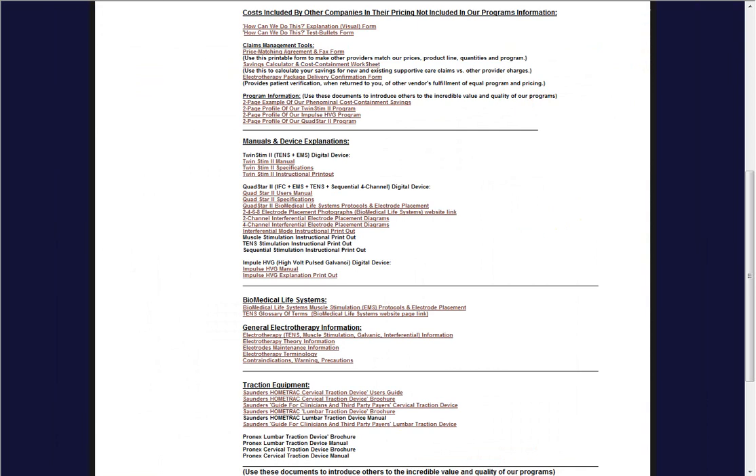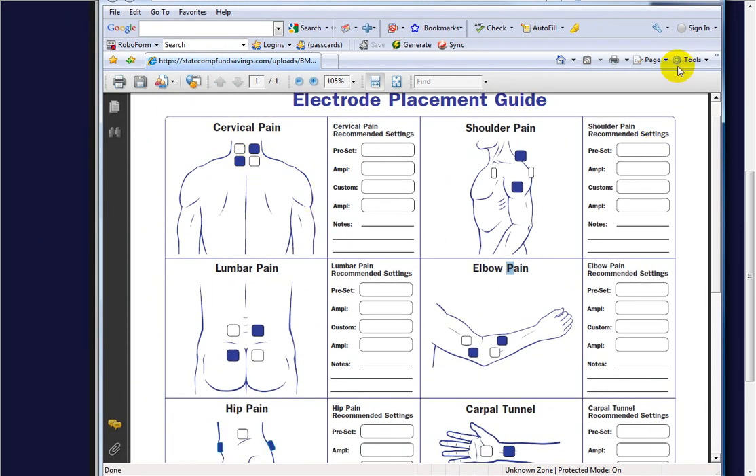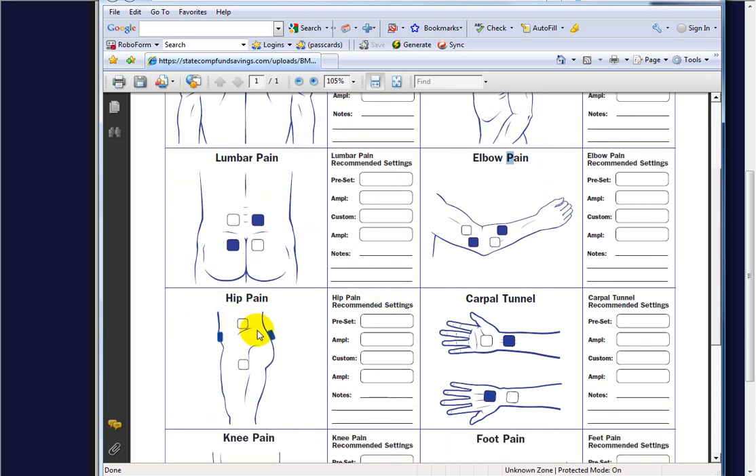Biomedical Life Systems is the manufacturer of our QuadStar 2. For cervical pain, one lead wire would go bottom left to top right, and the other top left to bottom right, so the current criss-crosses. The diagrams show different pad placements — you don't want to put electrodes right on bone; you want to give it some space. When the currents interfere at the center it spectrums out, and you can either pinpoint a small area or work a large area, though you may need to turn the amplitude up. Hip pain placement is also illustrated.